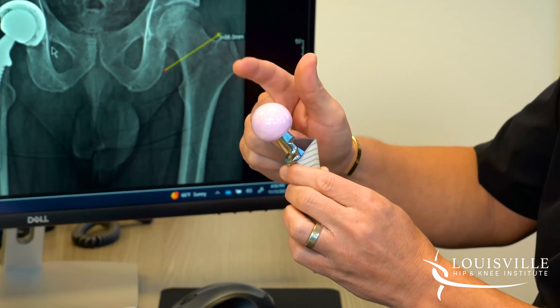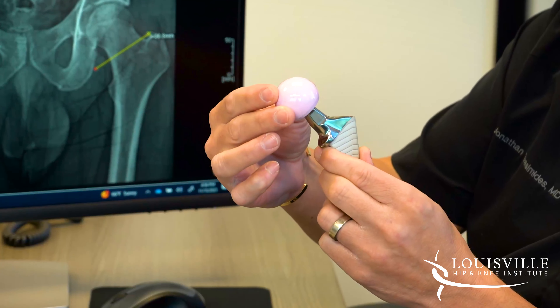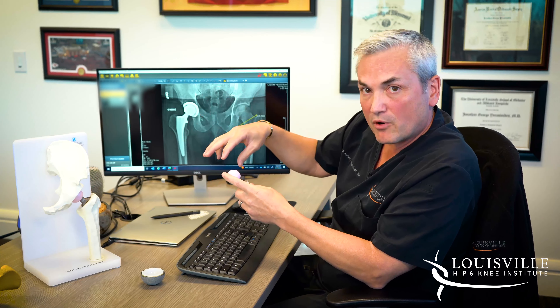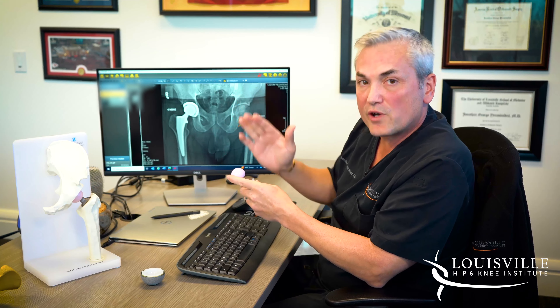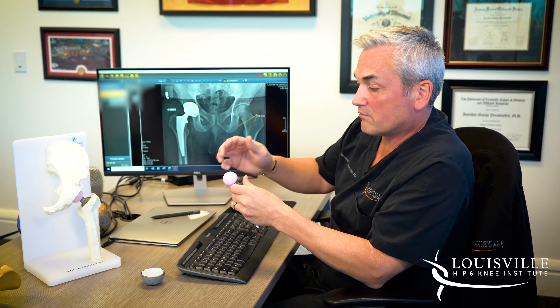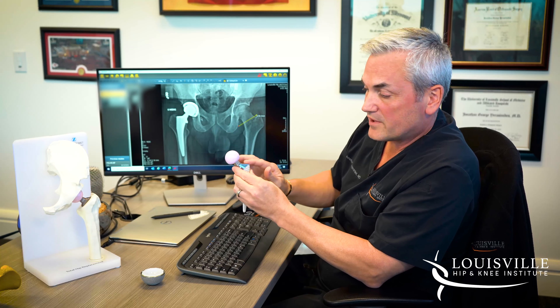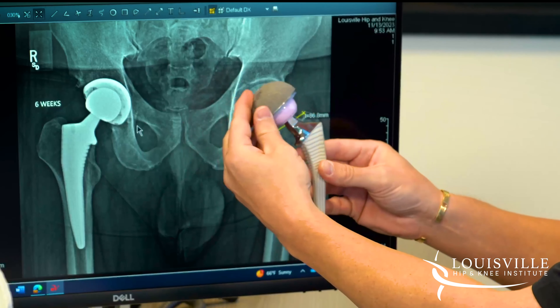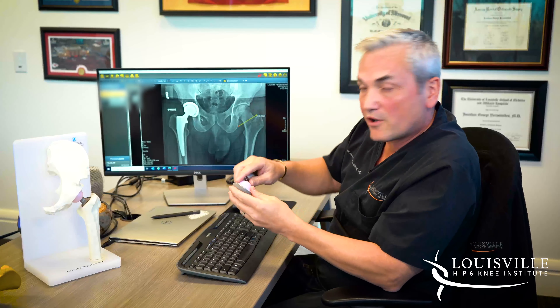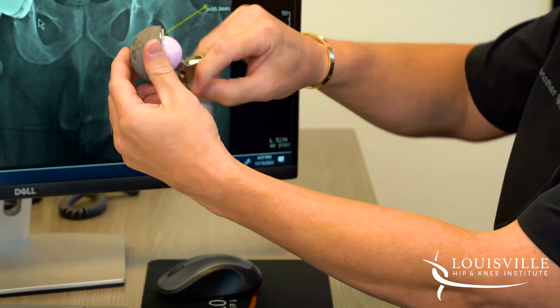Then we place a ceramic ball. These balls come in multiple sizes as far as length — they'll sit farther down or higher up on the trunnion, which is the neck portion of the stem. Through a process of trialing with dummy parts, we determine which ball is needed to recreate your leg length and ensure leg lengths are correct when you leave the operating room. The real ceramic ball then locks onto the stem and gets placed back into the artificial socket, becoming your new ball-and-socket joint. Because it's completely artificial, no pain can be generated from the joint itself, and because it's a round-on-round construct, full range of motion is restored.